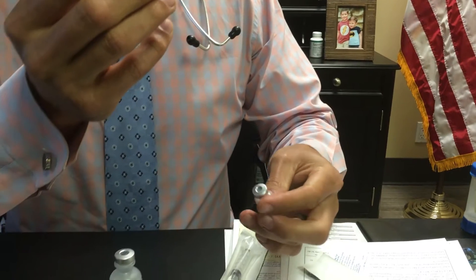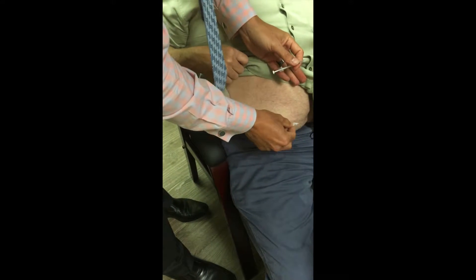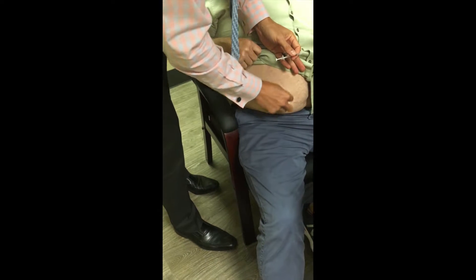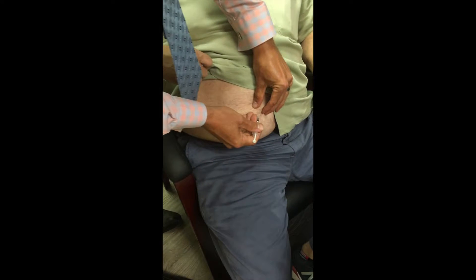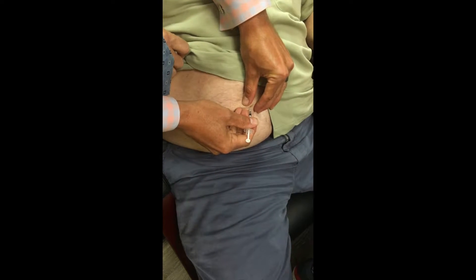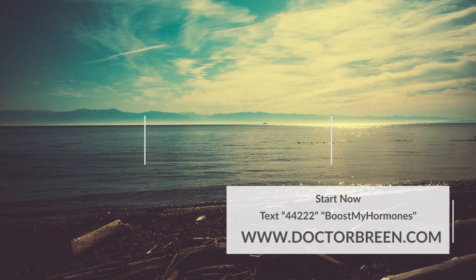Now you're ready to inject. You can inject either mid-thigh or anywhere in the abdomen. Take your alcohol pad, wipe from inside out to create a bullseye, pinch a little bit of skin, go straight in just like that, inject, and you're done.